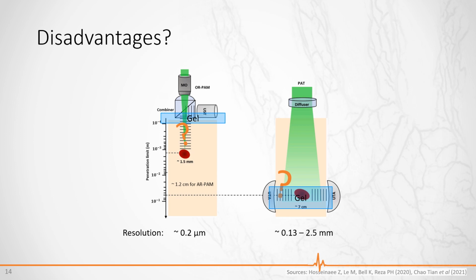Although this is a very common problem of solely optical imaging techniques as well, this does pose a problem for quantitative science and analysis. But despite those limitations, the technique certainly has its justification in many use cases. Let me show you some examples of what has been achieved already with PAI.